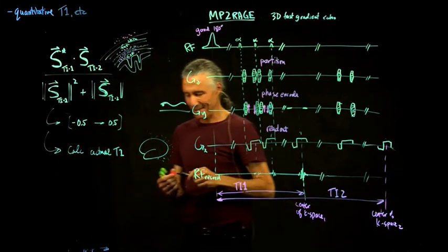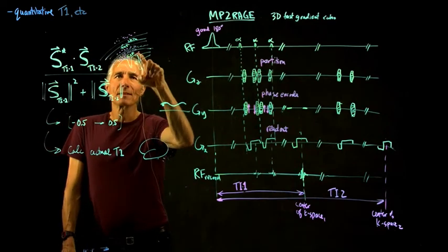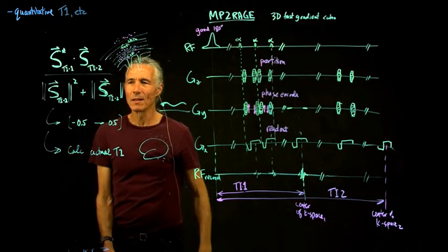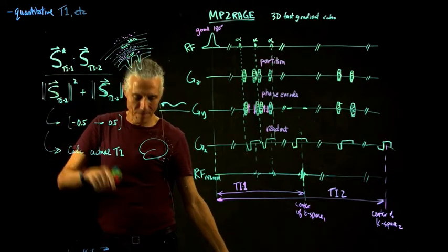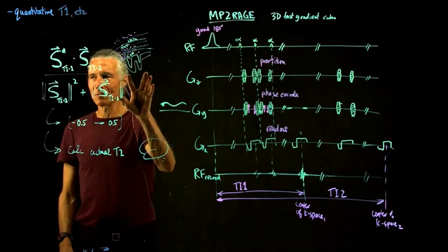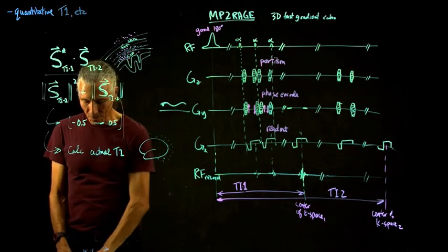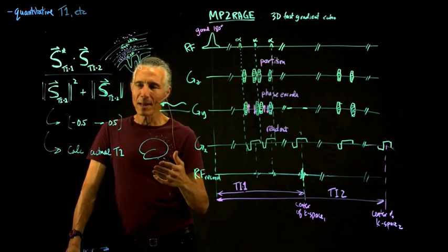So why is that? The problem is that the signal from the CSF, the inner table of bone, the outer table of bone, and the air is very, very small. When you take a very small noisy signal and do this to it, you get a noisy number. That's another reason why people haven't used these as much. Why is the air black in the first place?